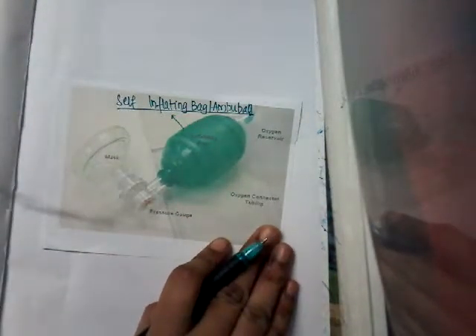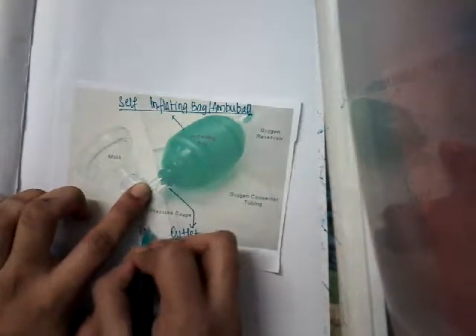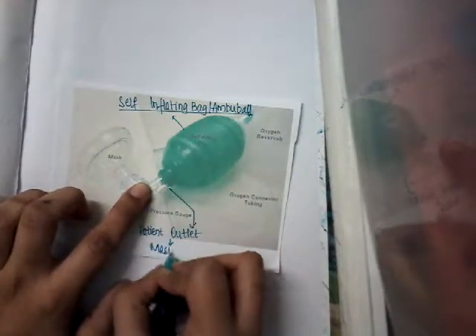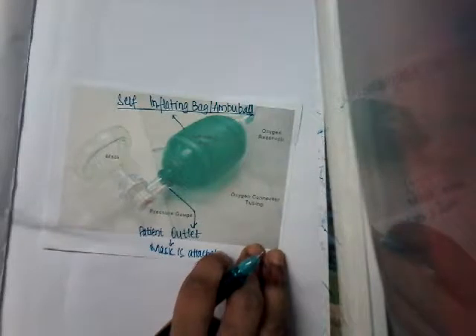The main parts of the self-inflating bag are: it has a patient outlet to which the mask is attached. It also has a one-way valve unit, and there is a pressure release valve to which a manometer can be attached.